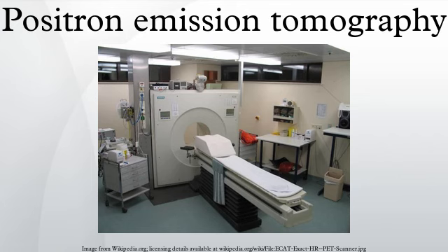18F-FDG, which is now the standard radiotracer used for PET neuroimaging and cancer patient management, has an effective radiation dose of 14 mSv. The amount of radiation in 18F-FDG is similar to the effective dose of spending 1 year in Denver, Colorado. For comparison, radiation dosage for other medical procedures ranges from 0.02 mSv for a chest X-ray and 6.5 to 8 mSv for a CT scan of the chest.